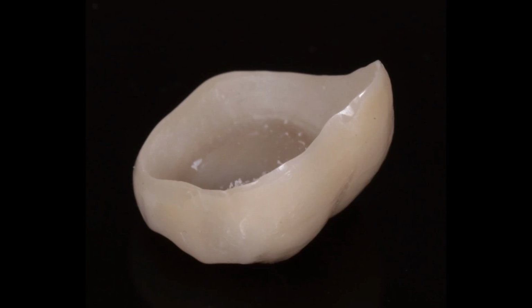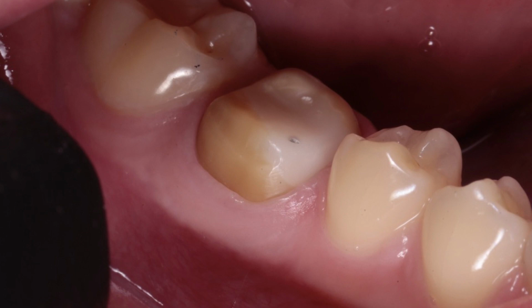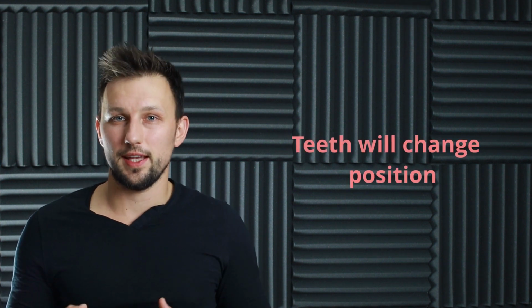I got the crown from my dental technician and I checked whether the crown is finished in a good way, so whether there is a smooth margin of zirconia at the bottom of the crown, and everything was perfectly done by my technician. The problem with this patient was the fact that he lost his temporary crown 3 days before the visit. As you know, when we lose the temporary crown, it's a very common risk that the neighboring teeth can move a little bit.